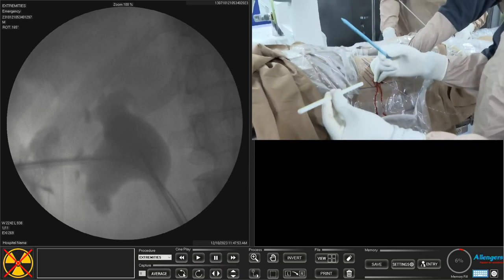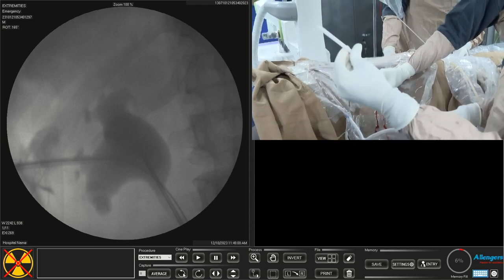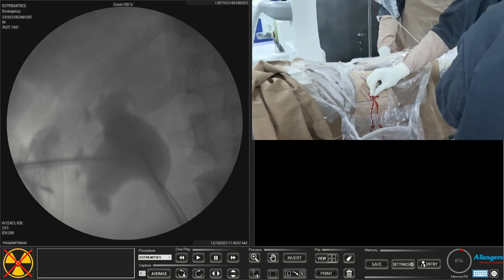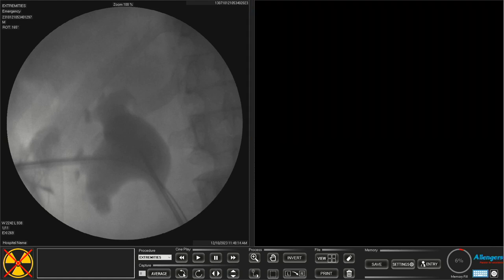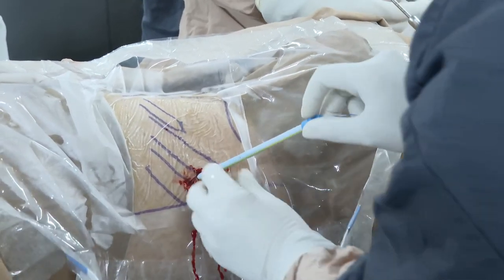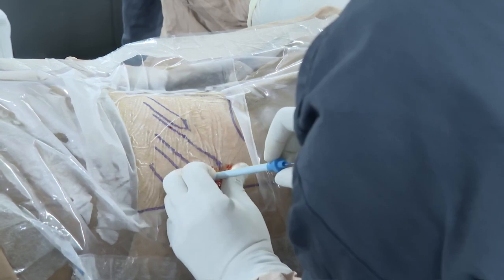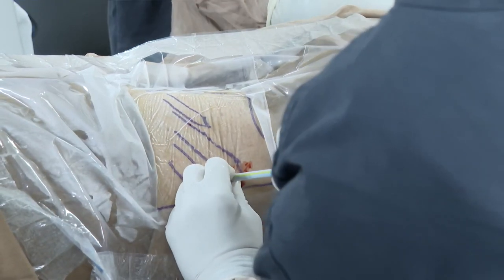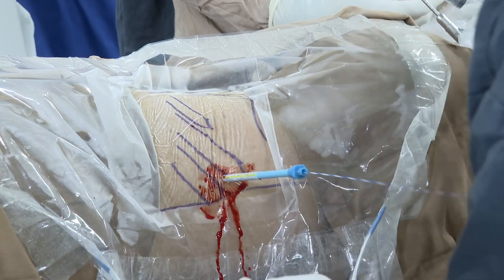My new preference is to do mini PCNL most of the time with 18 French, but today I am demonstrating this straw as a working sheath — it does not cost money so you can save money. It is non-radiopaque and collapsible, but since this kidney is hydronephrotic it is suitable. I gently advance the 20 French dilator, maintaining my angle throughout. I can also check with fluoroscopy to confirm dilation is within the system.